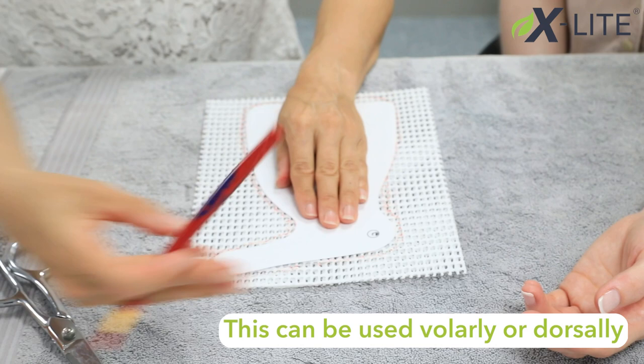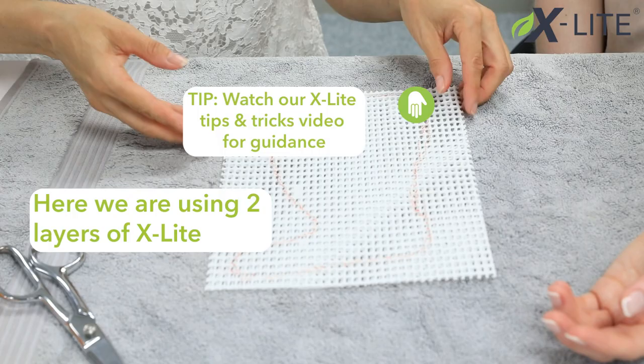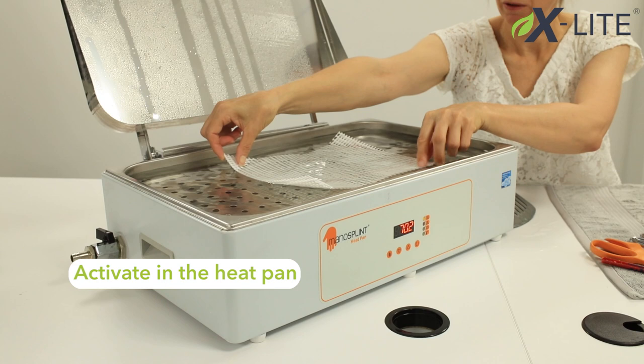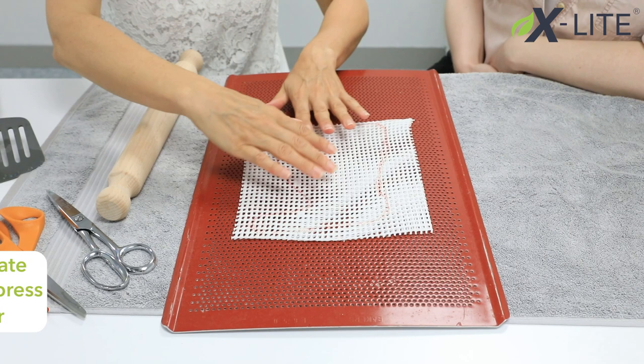Now transfer and draw around the pattern. Here we are using two layers of X-Lite. Watch our tips and tricks video for guidance on layering X-Lite. Now activate the material in the heat pan, then use the silicon plate and rolling pin to press the layers together.